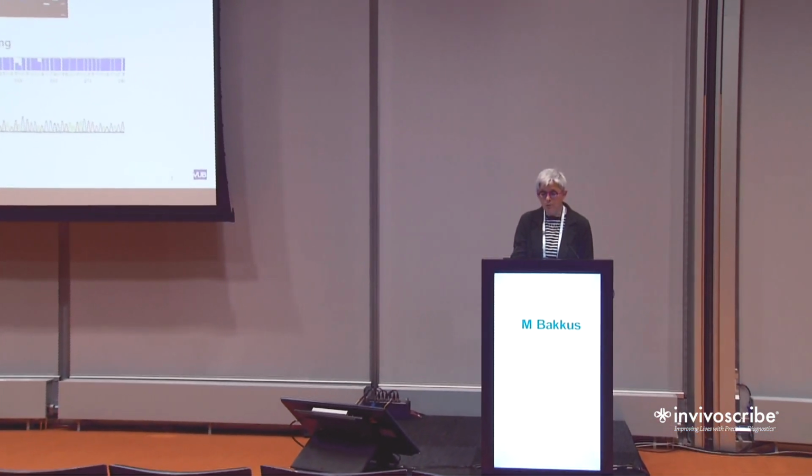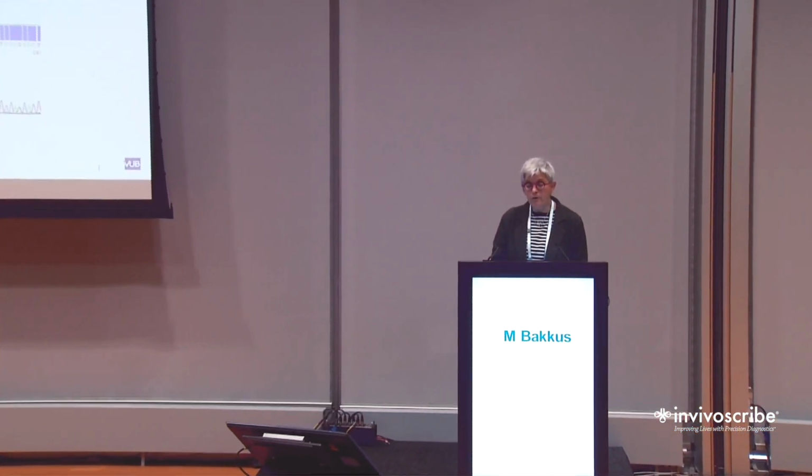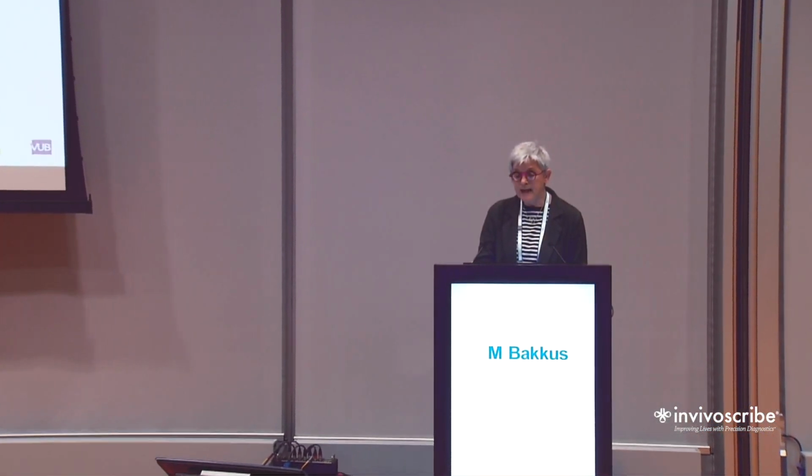You have the monoclonal peak of leukemia, you purify these clonal bands, most times by PAGE purification, and then you do Sanger sequencing and compare the sequence in an IMGT database to annotate the V, D, and J segments, with your N insertions in between. Your ASO primers are then designed over these junctions so that you get really specific primers that can only amplify this region.